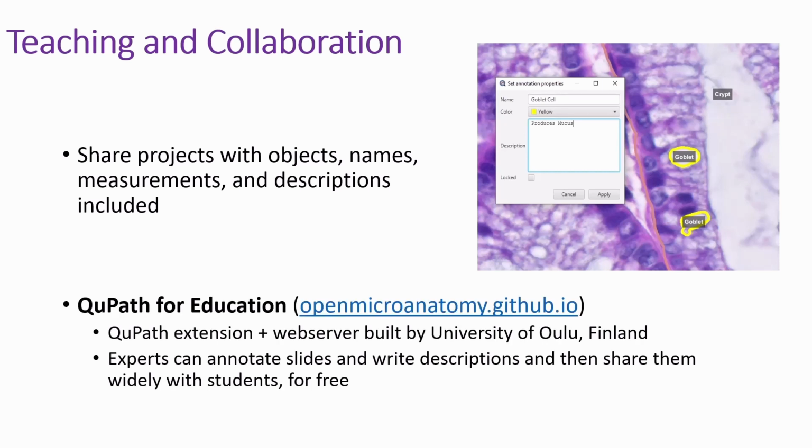drive. I also want to point out an extension to QuPath written by people at the University of Oulu in Finland. This is called QuPath for Education, and it's at openmicroanatomy.github.io. And this is a way for experts to annotate slides and write descriptions and then share them widely with students for free. And it's honestly really neat.